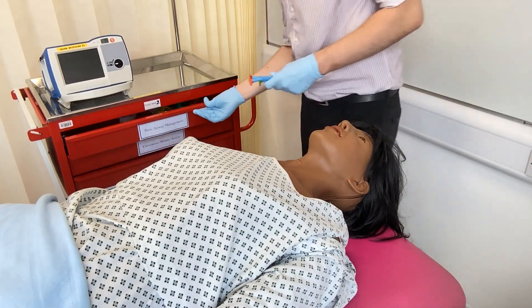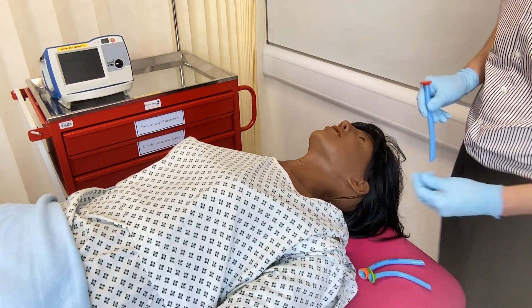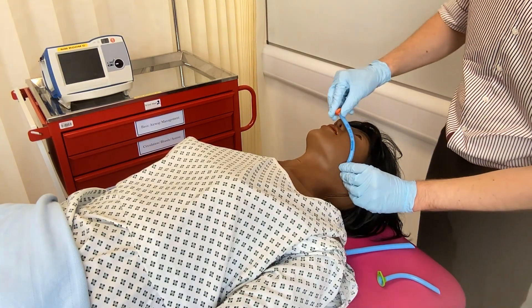A nasopharyngeal airway, or NPA, is inserted into a nostril and rests at the base of the tongue, maintaining airway patency. Common sizes are 6, 7 and 8. Size the NPA from the nostril to the tragus of the ear.